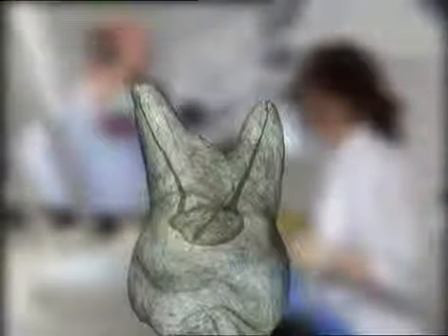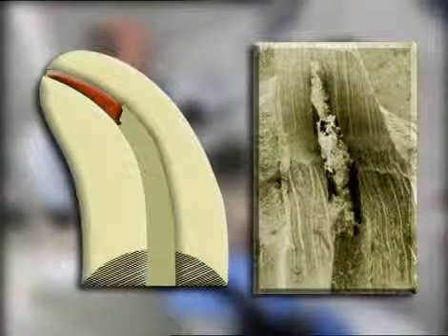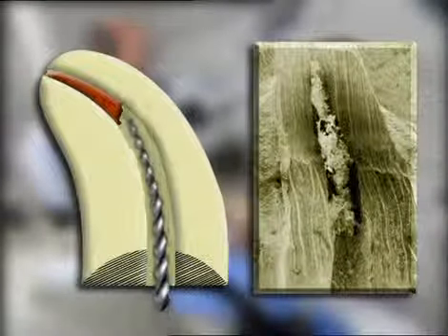The root canal preparation should occupy as many planes as are presented by the root canal system, that is, multiple planes. This objective preserves the natural curve, or flow. The apical foramen should remain in its original spatial relationship, both to the bone and to the root surface, without any type of transportation.